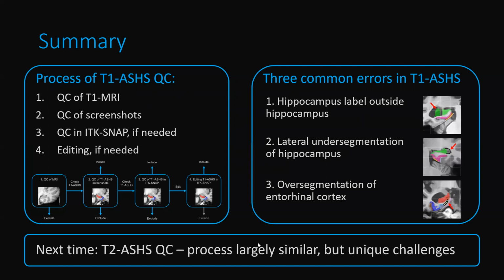And I will also have a T2-ASHS QC tutorial that I can hopefully upload soon. And here the process is largely similar, but T2 has higher res, so you can see more, and that gives some unique challenges and things that you need to look at.